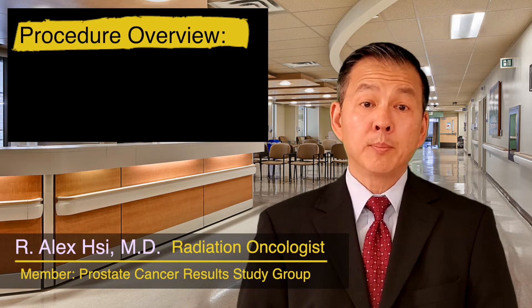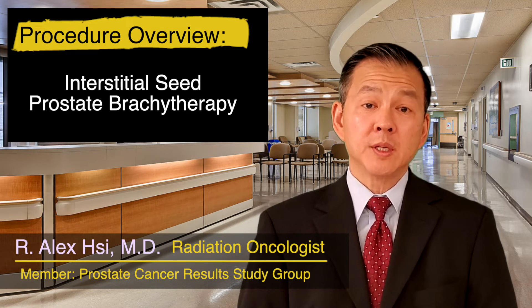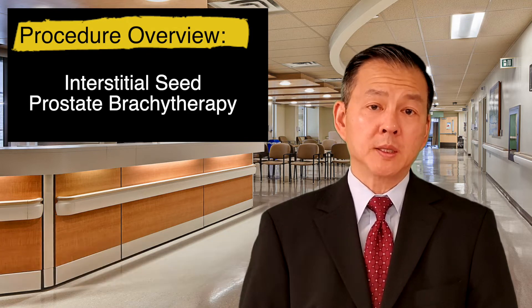Today I'd like to review with you a procedure known as interstitial seed prostate brachytherapy. This is an outpatient procedure that takes about 45 to 60 minutes to complete.